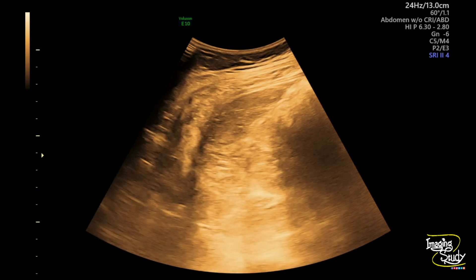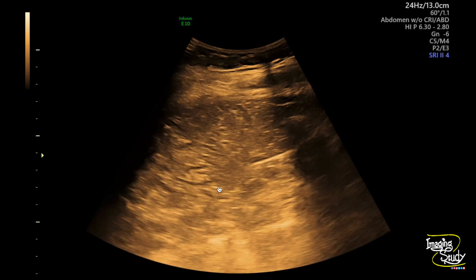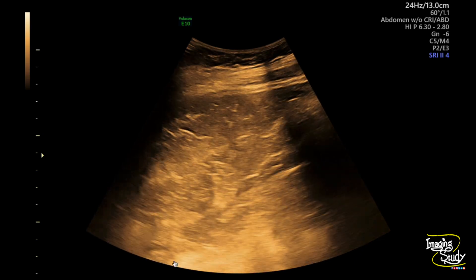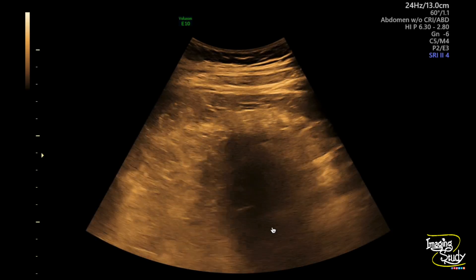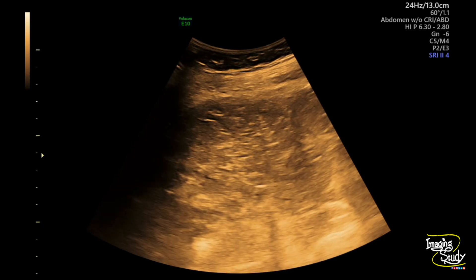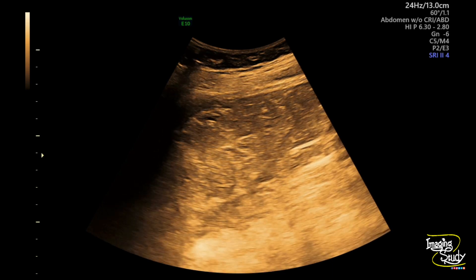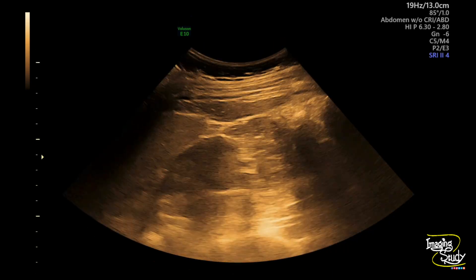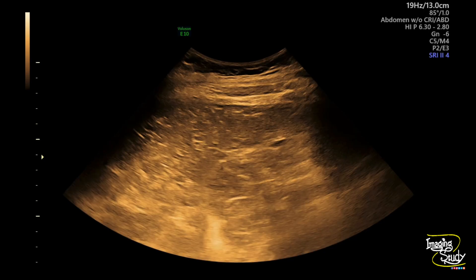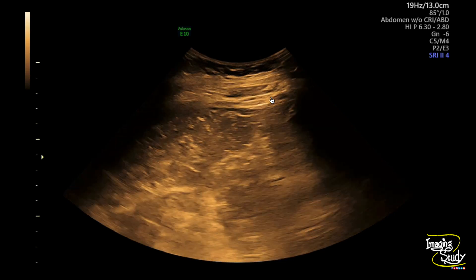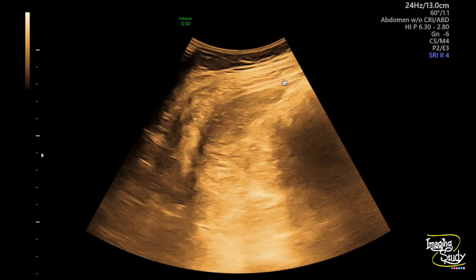Here you can see the right subhepatic region. You can see a large fatty tissue intra-abdominally. This is very unusual at this part, and you can see no bowel here — the bowel has actually been displaced. You can see a glimpse of the right hepatic lobe and the right kidney. This large subhepatic fatty area, which is displacing adjacent bowel, represents abdominal lipomatosis.